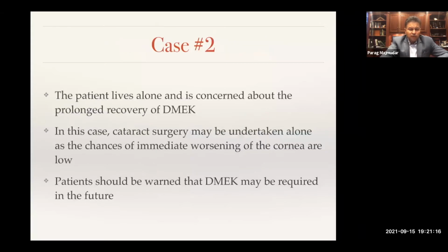And so this patient was the one who I said had some social issues. She lived alone. She was concerned about prolonged recovery. And so I said, yeah, if you think a week or two is going to be difficult, especially when they have an air bubble in, they may not be able to get around as well. In this case, the patient had the other eye, which she could have fallen back on, but she just didn't feel comfortable. So we had a long discussion and I said, look, I think cataract surgery alone is an option and we can do it.